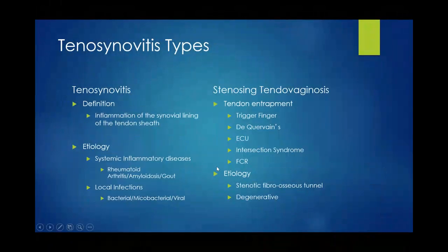Moving on to the different types of tenosynovitis. This is more of a for your information kind of grouping of slides. Essentially, tenosynovitis can be broken up into inflammatory causes and what I would consider non-inflammatory causes or stenosing issues.